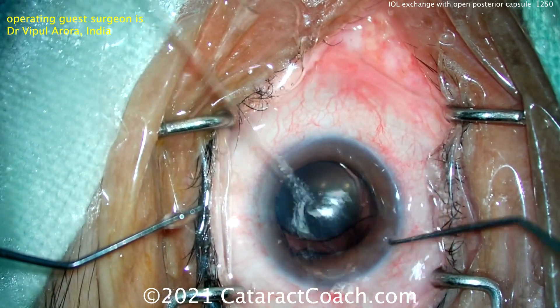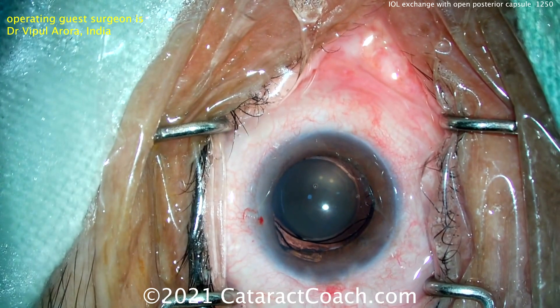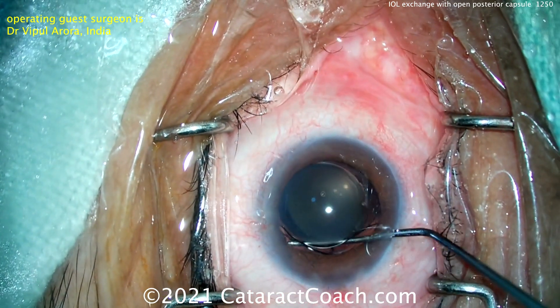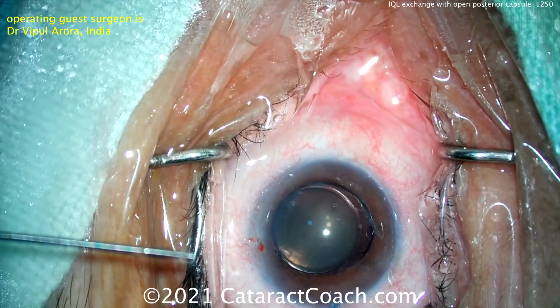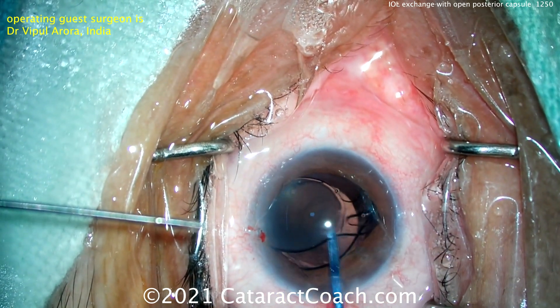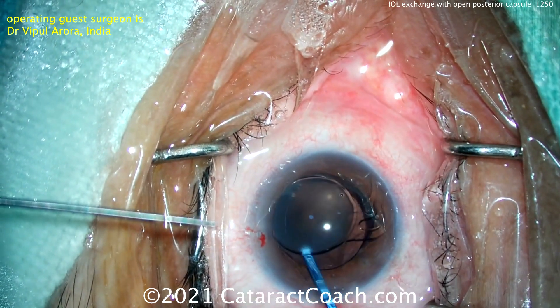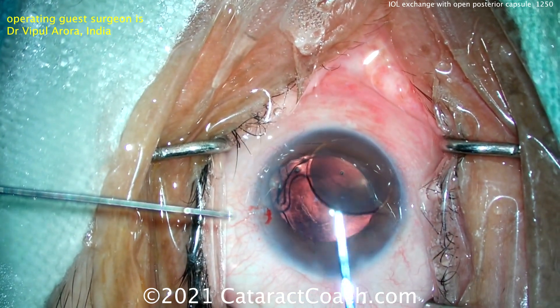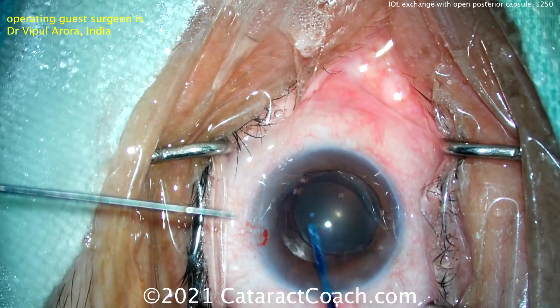Be careful when you manipulate this — if you put any pressure on that posterior capsule, you could open it up even more. In that case, you may want a sulcus lens. This new lens going in the bag is a single-piece acrylic, only suitable for in-the-bag placement. Now to remove the existing lens — if you're a CataractCoach fan, you should be doing the twist-and-out technique. Search for it at CataractCoach.com, search keyword T-W-I-S-T, and you'll see the technique. Also published in JCRS — how to explant this lens through an unenlarged 2.5mm incision.